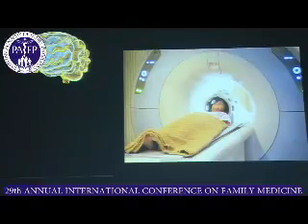The magnet, when it pulls up, it actually causes traction. More than that, it is the RF beam which hits the metal, which heats it up. That is what is more relevant and dangerous rather than simply placing the person in the metal.